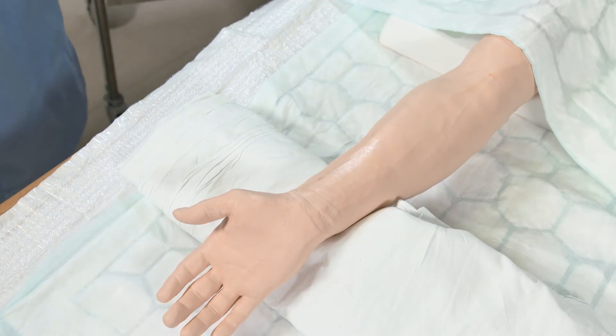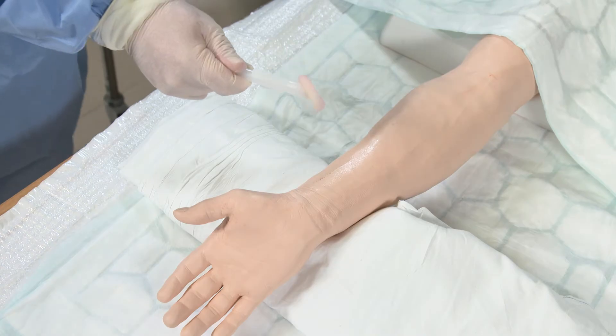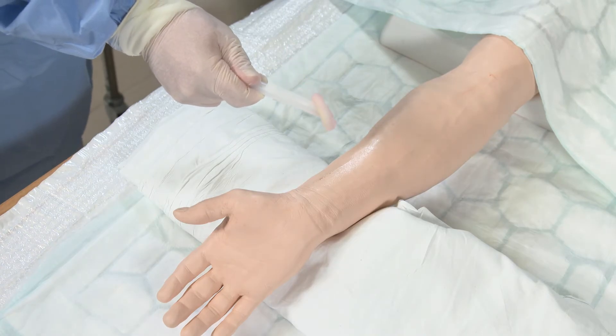We're now going to demonstrate arterial line insertion. Prior to this point you will have palpated bilaterally the patient's radial arteries and decided which side you're happier with. To start, we'll position the patient with their wrist extended as shown to give you easier access to the radial artery. We will clean the site using a 2% chlorhexidine lollipop.